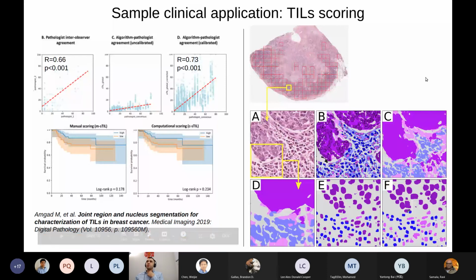And what you're seeing on the right here is just some of our existing work preparing better and better algorithms for quantifying these structures, these tumor infiltrating lymphocytes, using the annotations that we've obtained. And that's part of a TIL scoring global effort that Roberto Salgado and colleagues have championed, and we're one of the groups that are participating. It's by invitation, but I assume if someone wants to contribute their algorithm, they can directly talk to Dr. Roberto, and he would probably welcome that.